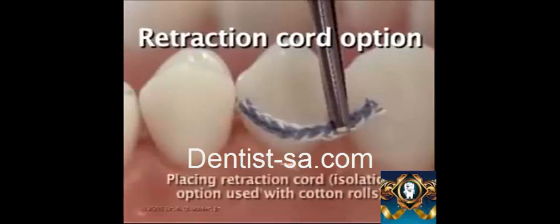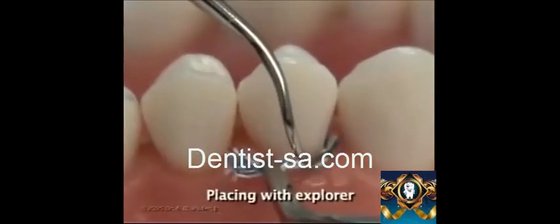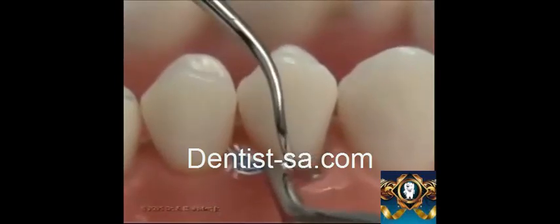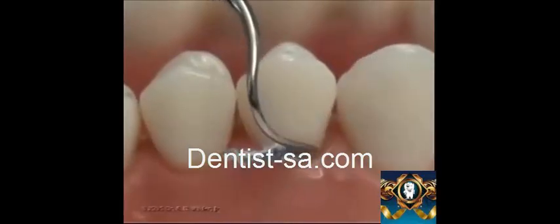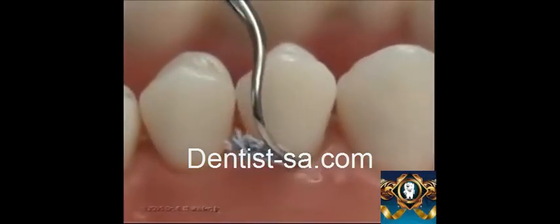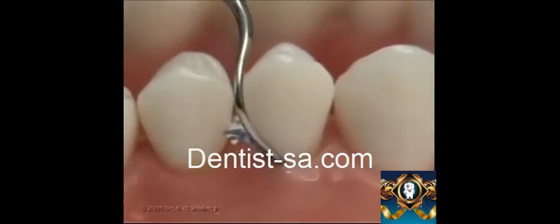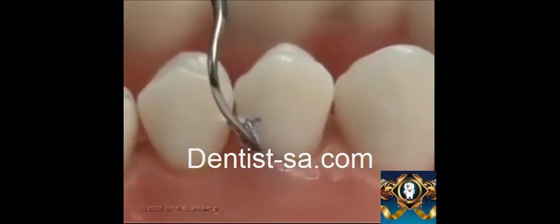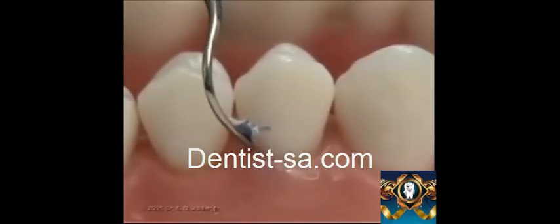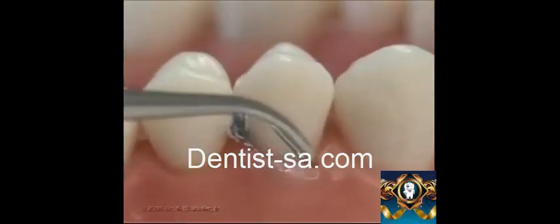Class 5 preparation and restoration could also be done without the application of a rubber dam by the use of a gingival retraction cord, which should be placed completely immersed into the gingival sulcus. The retraction cord could be placed using an explorer. Once the retraction cord has been completely immersed into the gingival sulcus, it is left there for 1 to 2 minutes, after which it is removed and the gingival sulcus will have been widened for better accessibility for restoration of a Class 5 lesion.